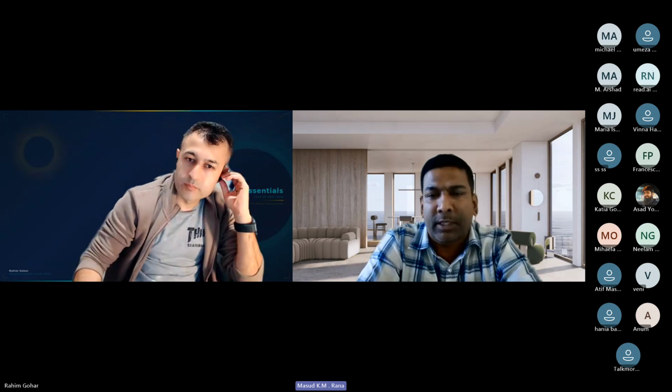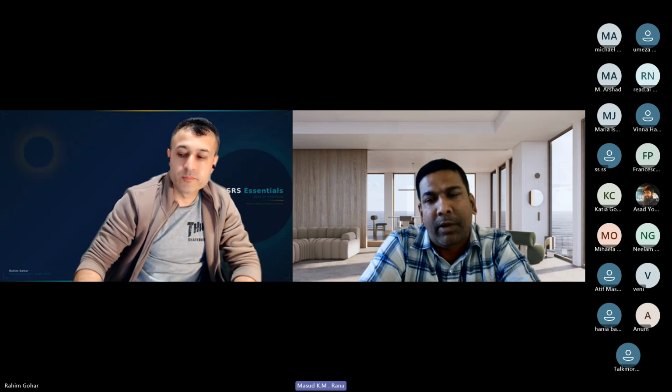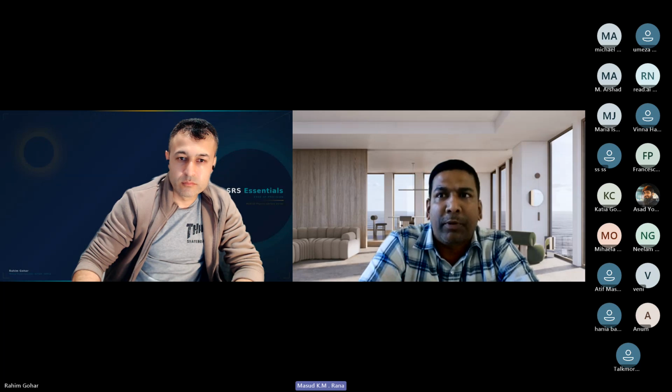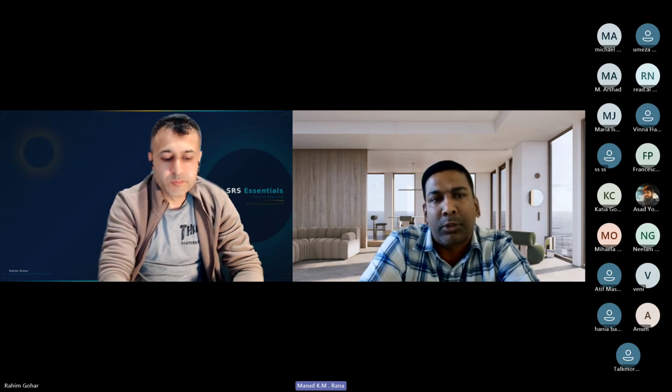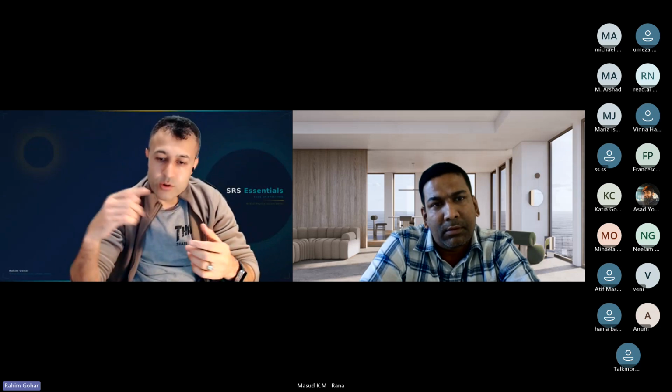So, a follow-up question: when you treat this patient, let's say you have an SRS plan and it includes some couch kick. Do you prefer that every fraction should be checked with the CBCT because there is a couch kick and motion? No, you can't use the CBCT for the couch, right? So that's the whole aim, that you need that external imaging. We don't even use CBCT.